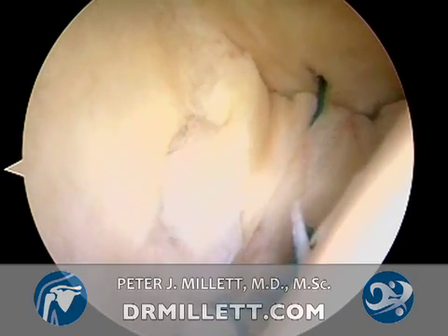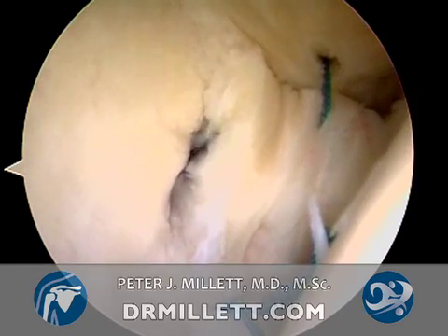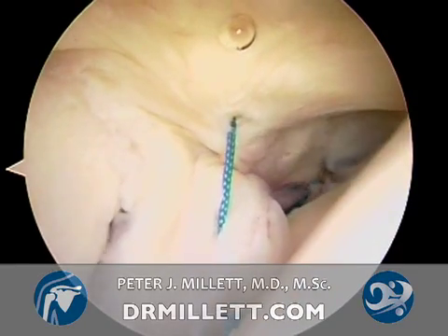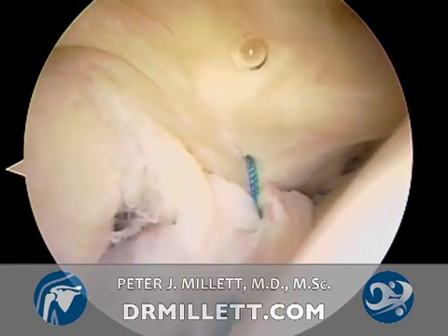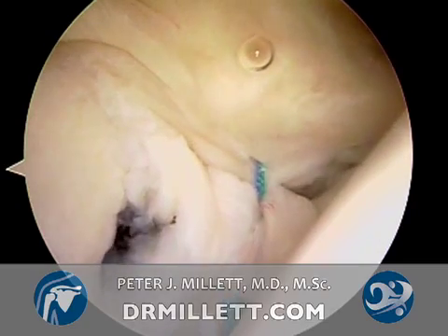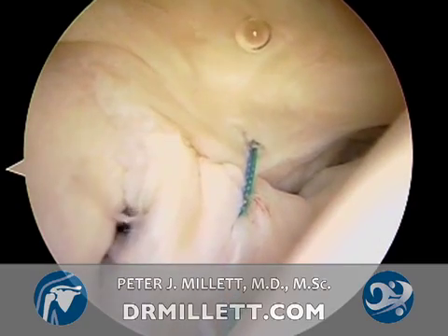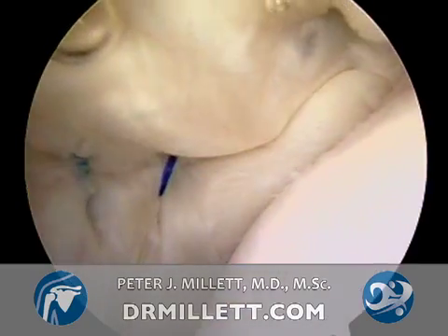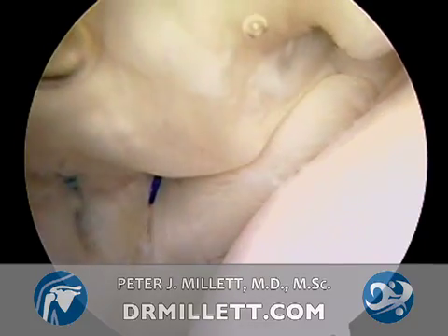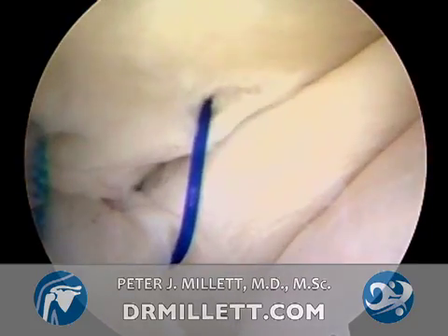The suture is then used to shuttle a non-absorbable stitch through the same tissue. A crochet hook is used to retrieve the suture limbs into the anterior cannula to avoid inadvertently capturing deltoid tissue. The sutures are tied extra-articularly, thereby capturing as much capsular tissue as possible.